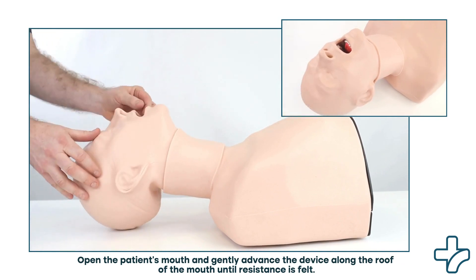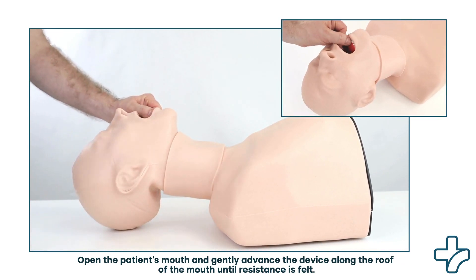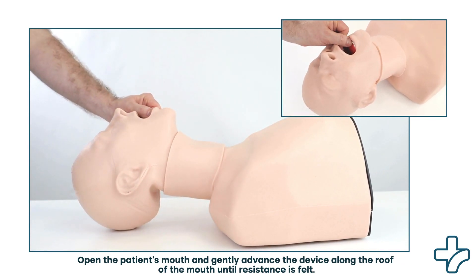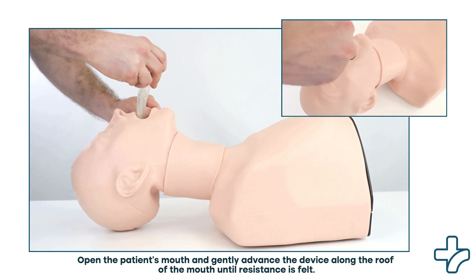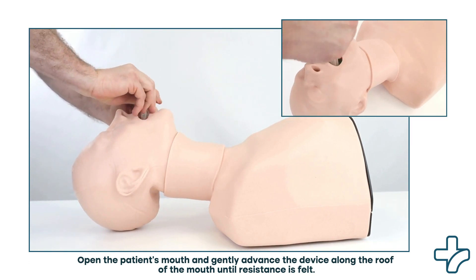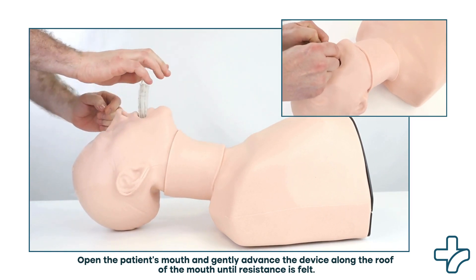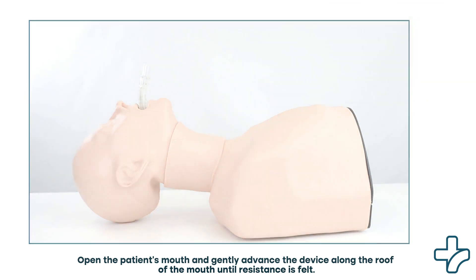To insert the supraglottic device, open the patient's mouth and gently advance the device along the roof of the mouth until resistance is felt. A jaw thrust maneuver may aid insertion.